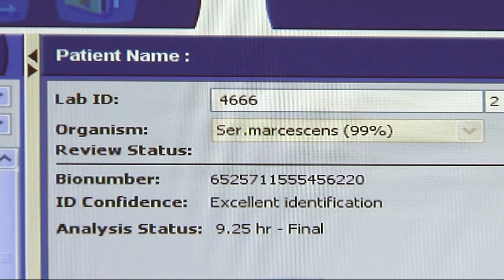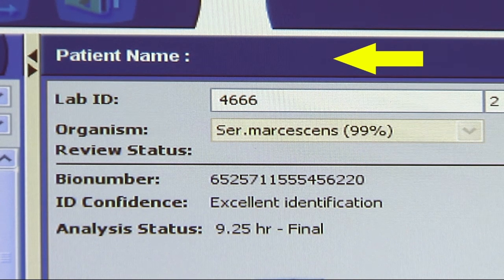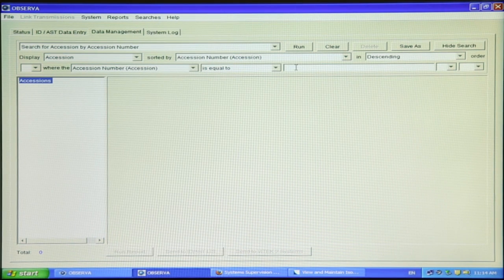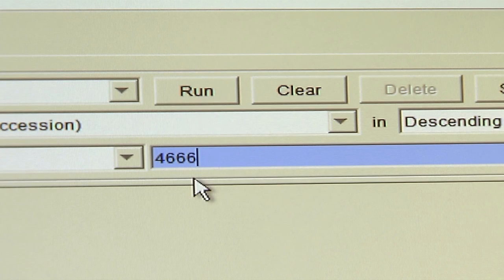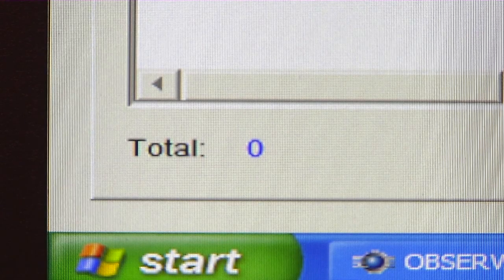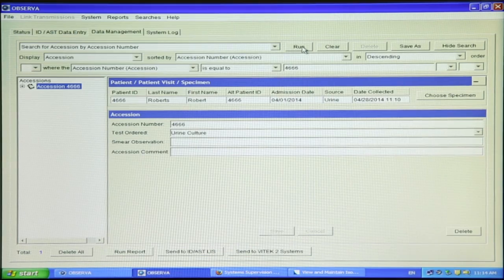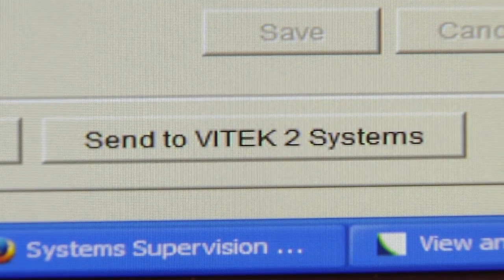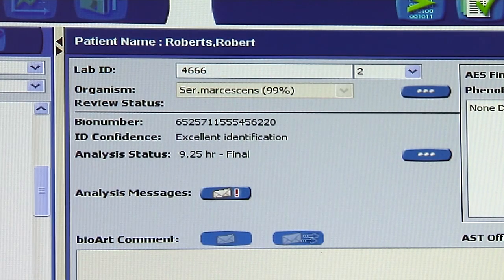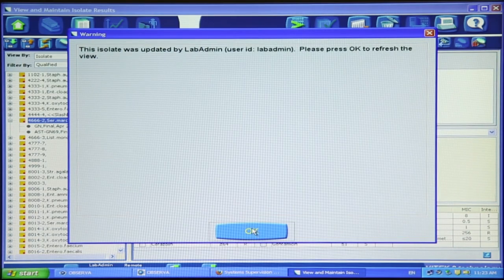Finally, we need to consider patient demographic issues. If patient demographics have been enabled in the Vitec-2 configuration, is a patient name displayed in the top center of the View and Maintain Isolate Results view? If not, the patient information must be re-sent from the laboratory information system (LIS) or Observa. If the Vitec-2 is connected to Observa, perform a data management search for the accession number. If the search does not return the expected accession number, or the Vitec-2 is not connected to Observa, resend the appropriate patient information from the LIS. If the search generates the expected accession number for the indicated patient, click the Send to Vitec-2 Systems button at the bottom of the screen. Return to the Vitec-2 View and Maintain Results view and confirm the patient demographics have linked to the isolate. Once linked, the software will analyze the results automatically.